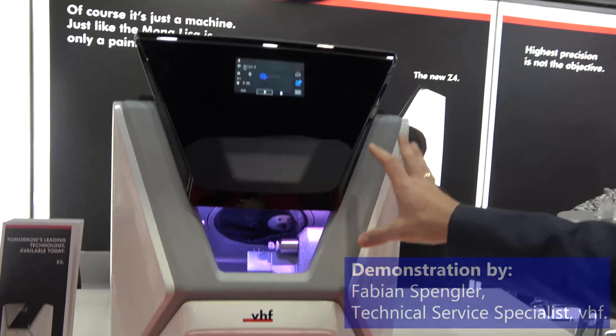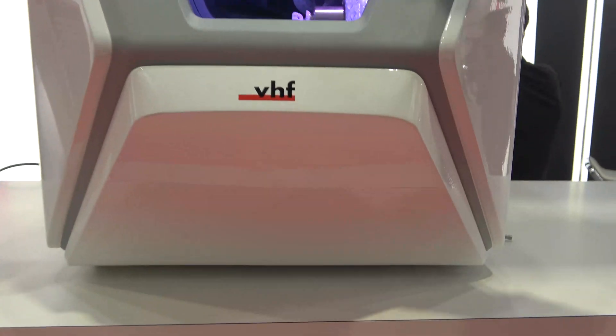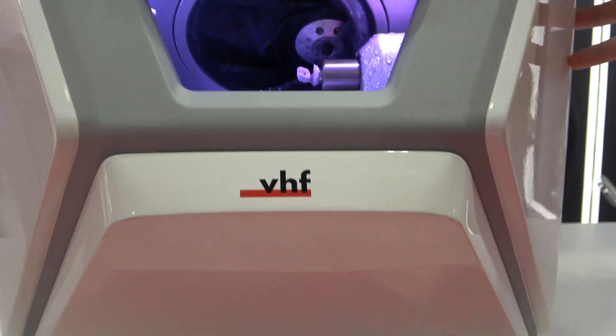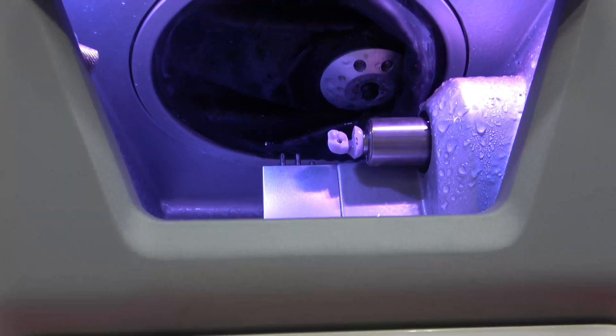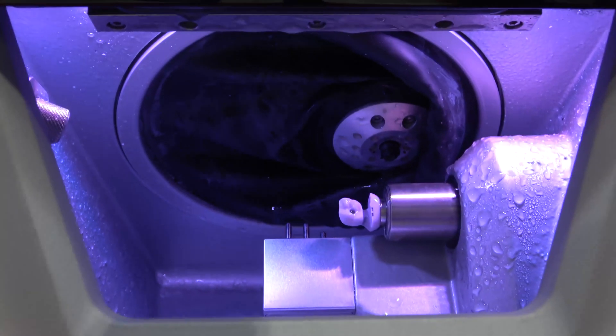Let me introduce the new Z4 machine from vhf. This is our machine suited for same-day dentistry. We have here a simple and compact machine — the compressor is integrated, and the PC is integrated.